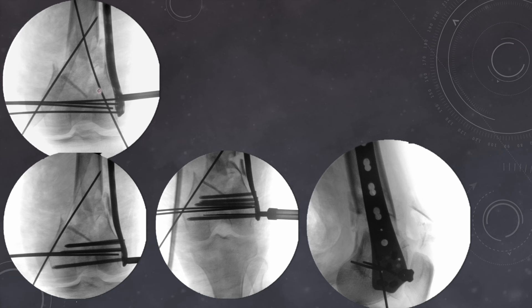Then only put all the screws in the terminal part, so that you are sure your articular fragment is perfectly aligned with the plate terminal part. The diaphyseal part will be addressed after you have gained good purchase of distal screws in the articular block. We have positioned the plate perfectly on the lateral surface in the distal segment. You have to ensure the alignment of the fractured distal fragment is correct in terms of varus and valgus — it should be slightly valgus. In a comminuted fracture, it is difficult, and you can use the diaphyseal axis to measure the angle of the articular surface with the diaphyseal axis to know whether it is correct or not. There is also an indirect method: see the direction of the sleeve — your screws should pass perfectly parallel to the articular surface.